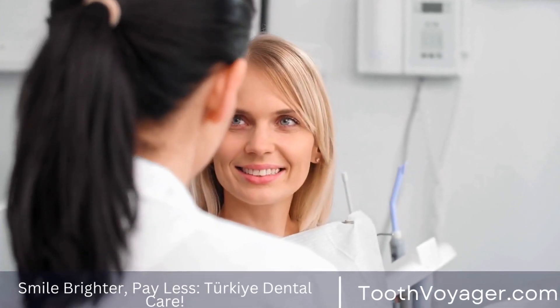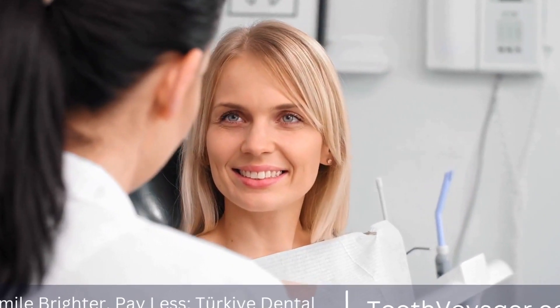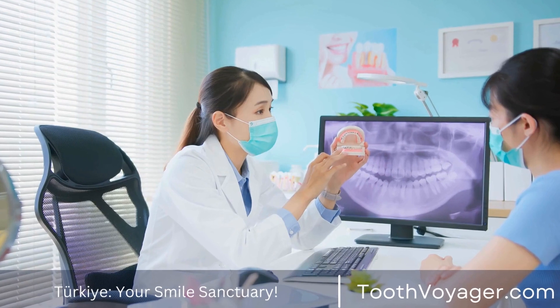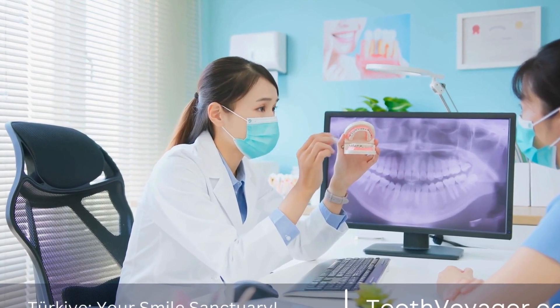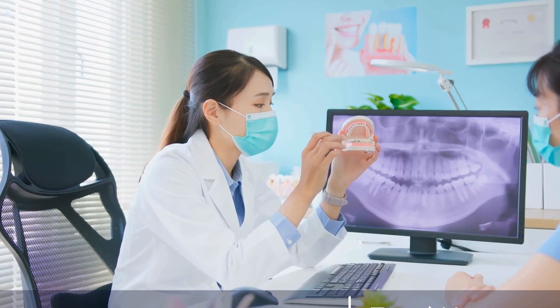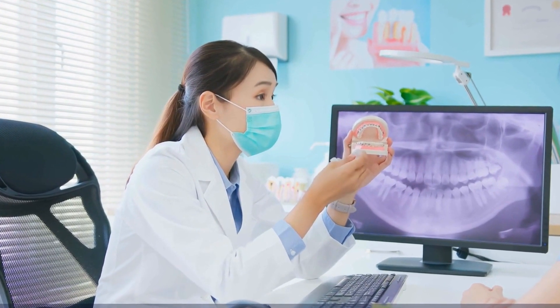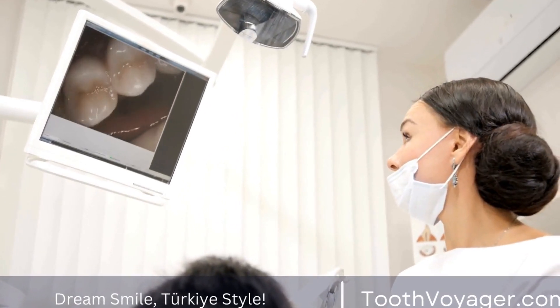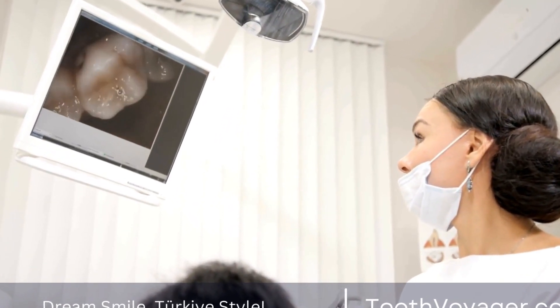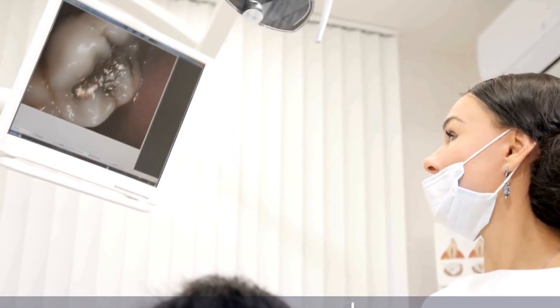In conclusion, dental x-rays play a crucial role in diagnosing oral health issues and planning effective treatments for patients. By providing detailed images of the teeth, bones, and surrounding structures, x-rays help dentists identify problems, develop treatment plans, and monitor the progress of treatments over time. With advancements in imaging technology and safety measures, dental x-rays continue to be an essential tool in the field of dentistry, improving patient care and outcomes.